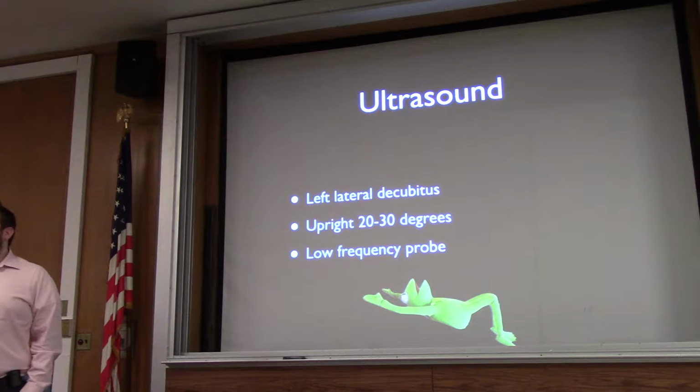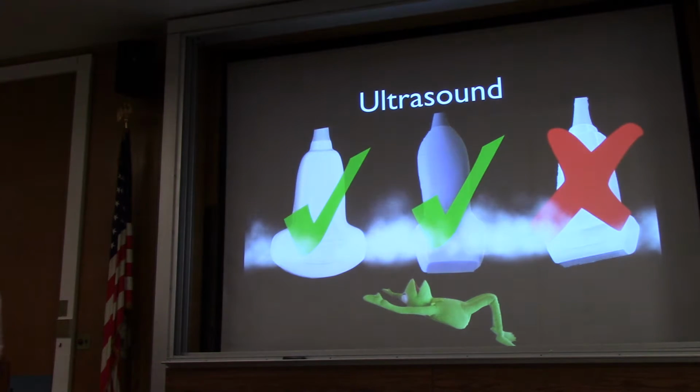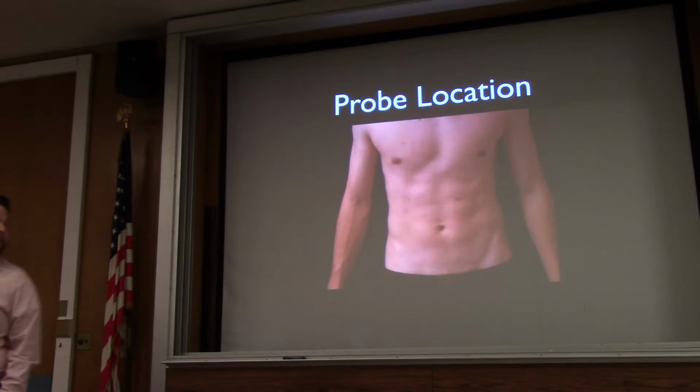Obviously you want to use your low frequency probe. If you don't know that, that's this one and this one. This is a high frequency probe.